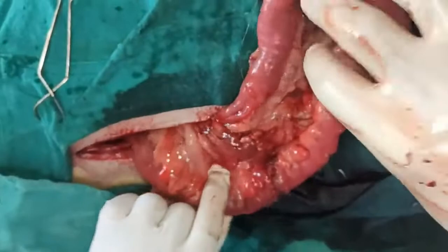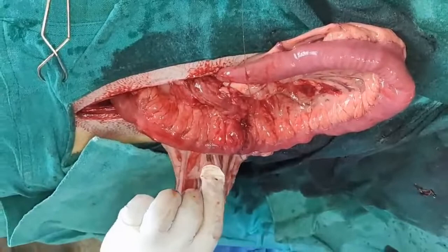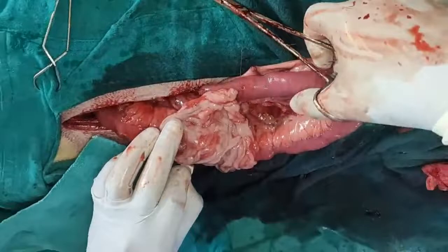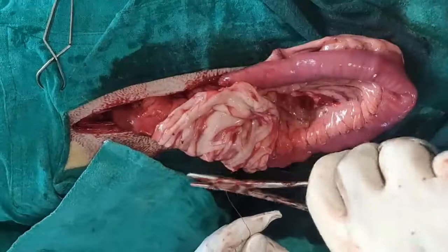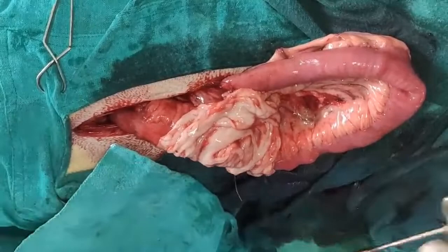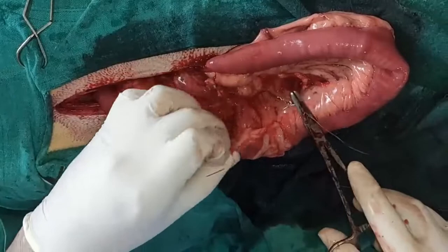This is the omentum. So the next procedure is I will suture this omentum over the repaired part of the intestine. That is very important, omentalization, so that even if there is one drop of leakage, it will not cause harm in this case. So you should not pierce the intestine wall anymore. Better to incorporate the mesentery.